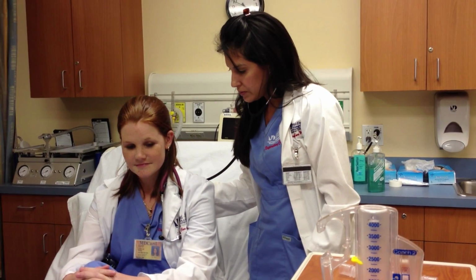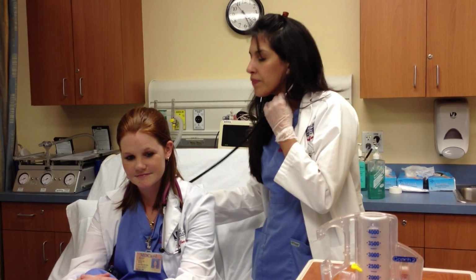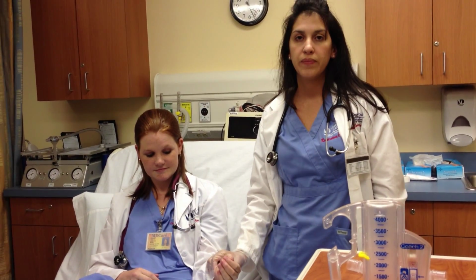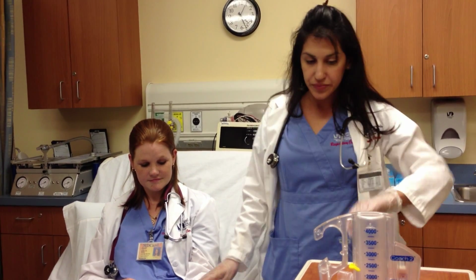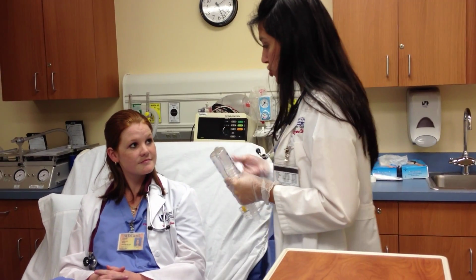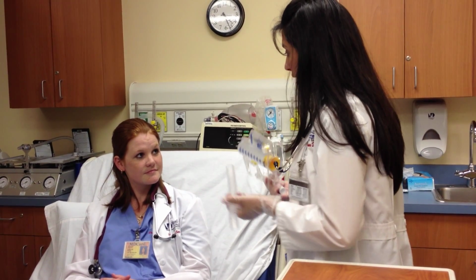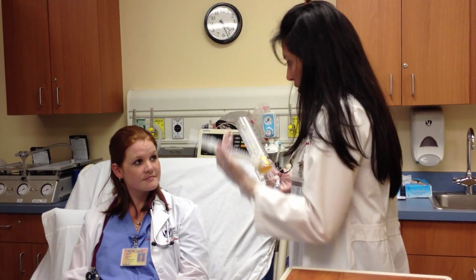Inhale and exhale, please. You do the complete breath sounds, and you take the heart rate and respiratory rate. Thank you, Krista. Now, Krista, since you're going to go to surgery, this breathing device called incentive spirometry is going to help keep you from developing lung complications like atelectasis, and it's going to help you by deep breathing, okay?